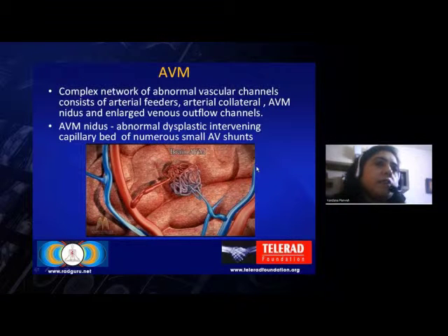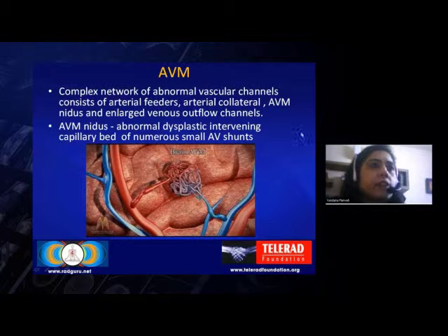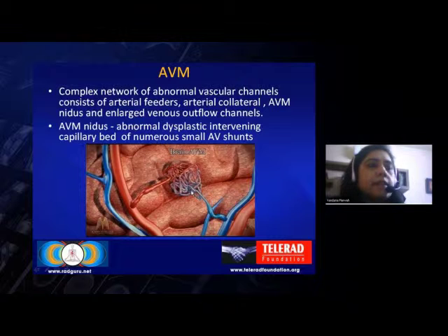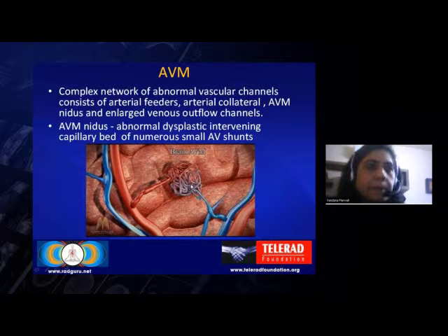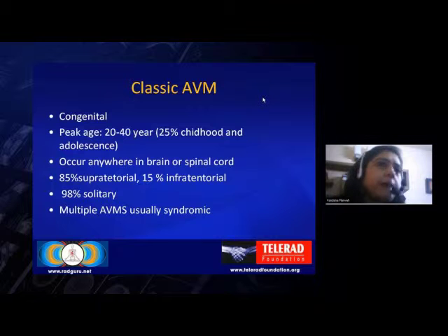Coming to the pial AVM, this is a complex network of abnormal vascular channels consisting of arterial feeders, arterial collaterals, the nidus, and enlarged venous outflows. The nidus is basically an abnormal dysplastic intervening capillary bed of numerous small AV shunts.